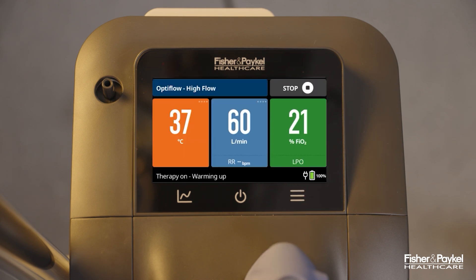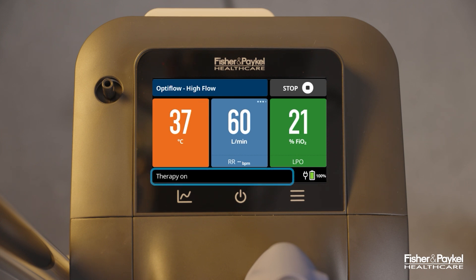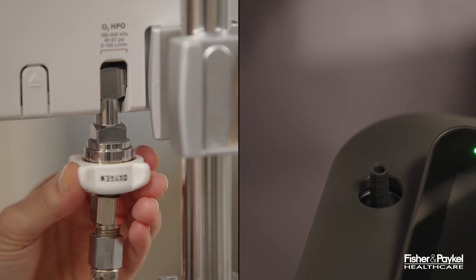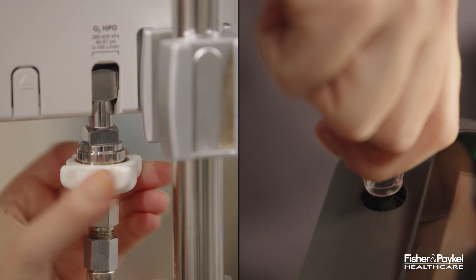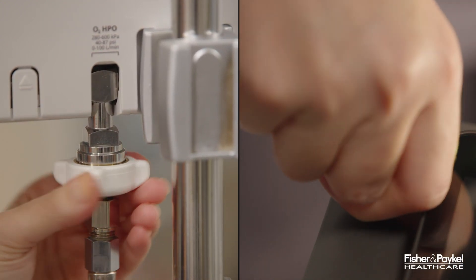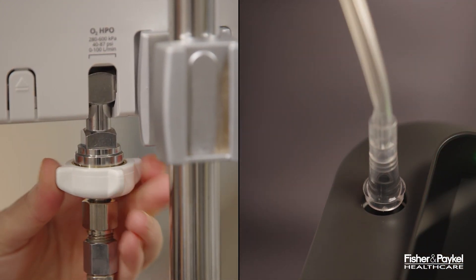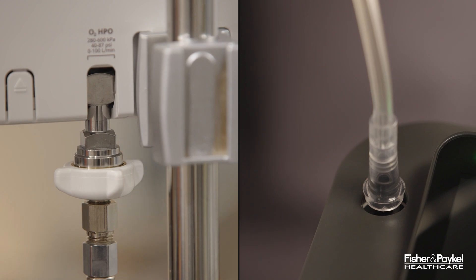When therapy initiation is not urgent, it is recommended to wait until the Evo3 displays 'therapy on' in the message bar before connecting the patient to the heated breathing tube. For patients that require supplementary oxygen, the Evo3 can connect to either high or low pressure oxygen sources.